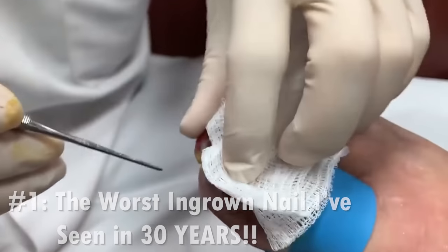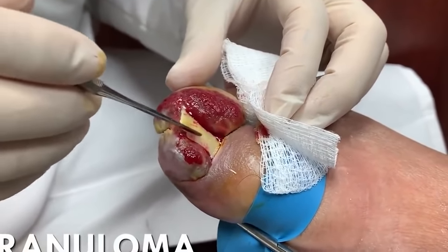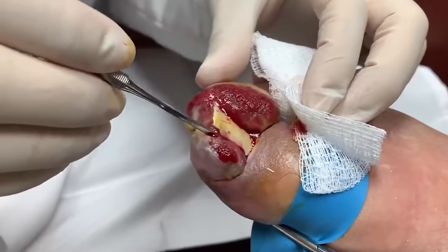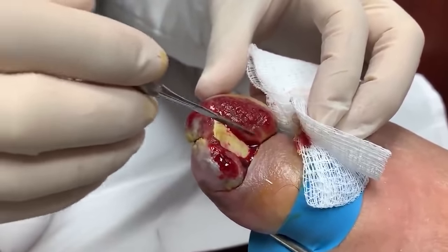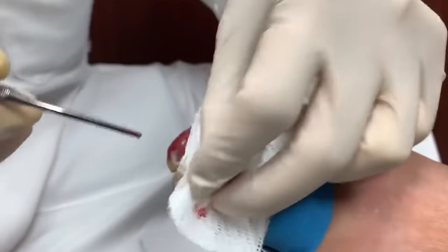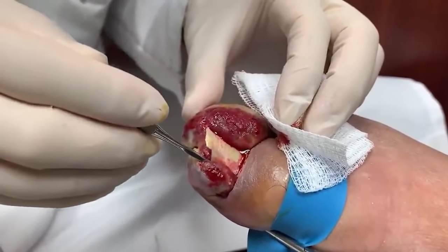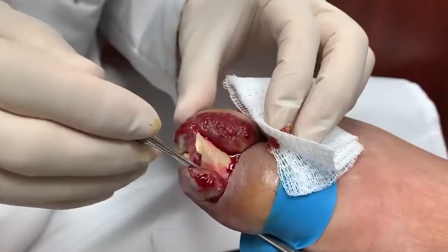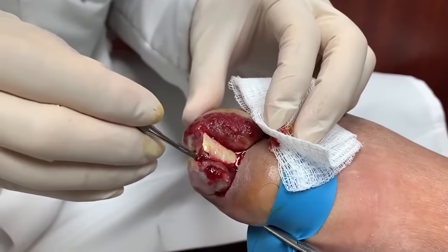The little one just started about a week ago. These are called granuloma — this is a reaction of the nail irritating the skin, and then your skin is trying to protect itself and forming a very large granuloma, almost looking like an extra toe. We need to remove this, but it gets really bloody if I cut on the granuloma too much, so I'm just going to take the offending border of the nail out.